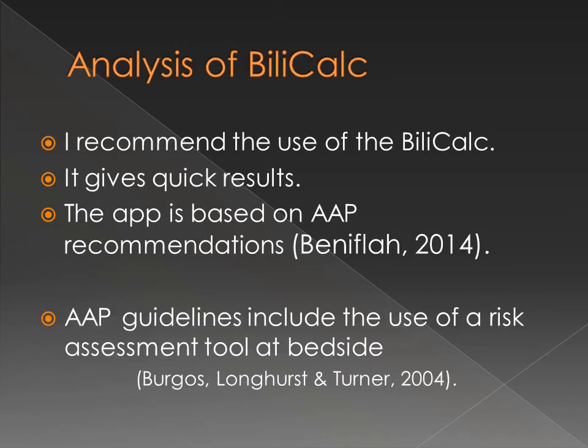I would recommend the use of the BiliCalc. It gives quick results. The app is based on the American Academy of Pediatrics recommendations, and the American Academy of Pediatrics guidelines include the use of a risk assessment tool at the bedside. Many healthcare professionals in the hospital setting do use this app or a similar app. It's easy, it's quick, it's portable, and the information is easy to read.